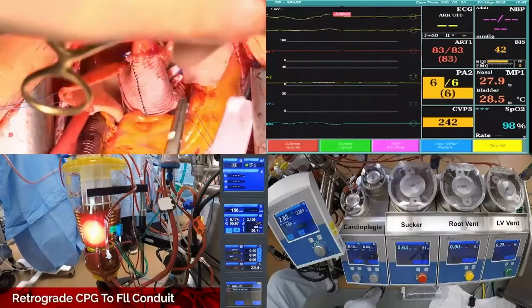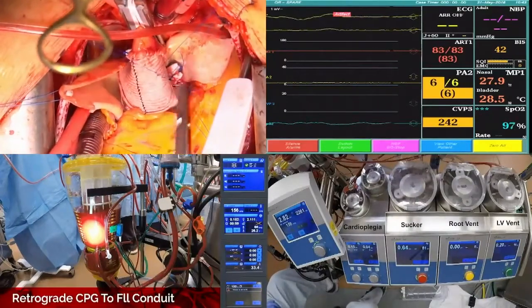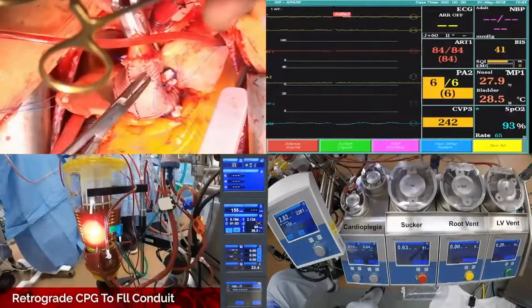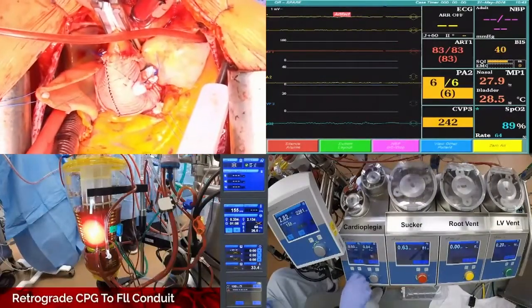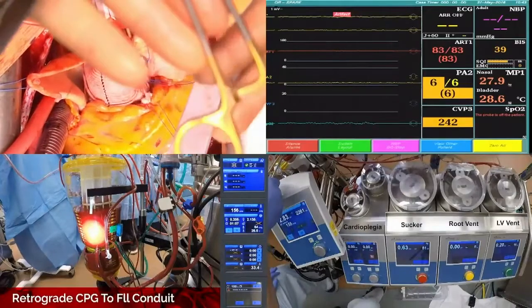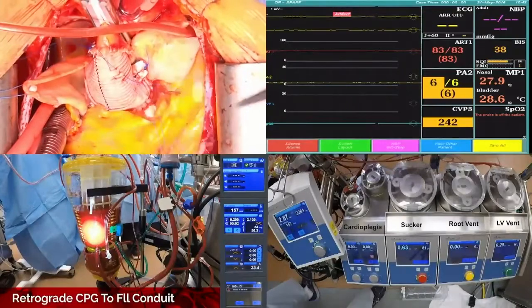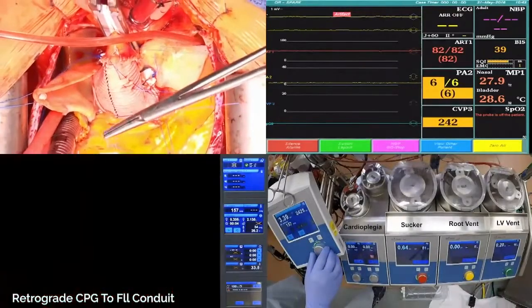So you should start seeing this. Of course the pressure you're going to get from that is going to be fairly slim. It's just helping you put the suture in. You're not testing your anastomosis. Exactly. No, I'm not testing it with that. Right. I'm de-airing. I'm also filling it up so I don't back wall it. Not that that's an issue. But also just time to get pleats.